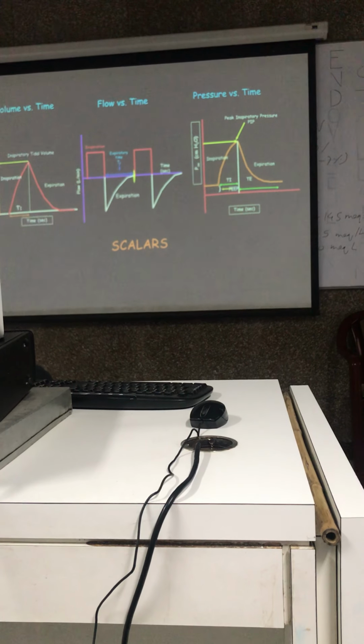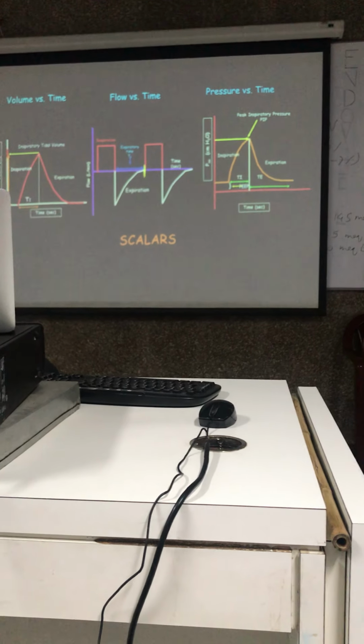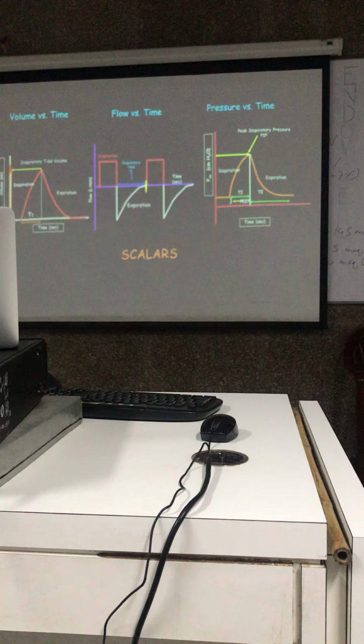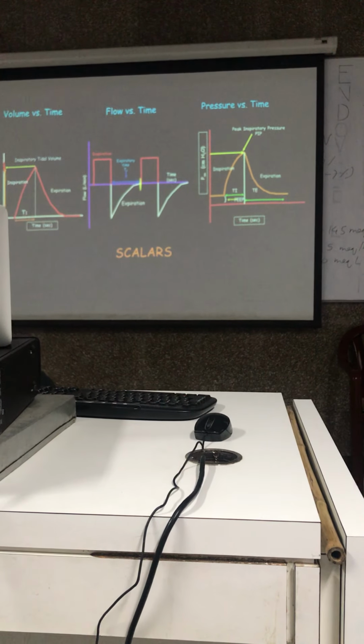So your scalars: the x-axis will always be time, and the y-axis will be pressure, volume, or flow. Okay, this forms the basis for scalars.